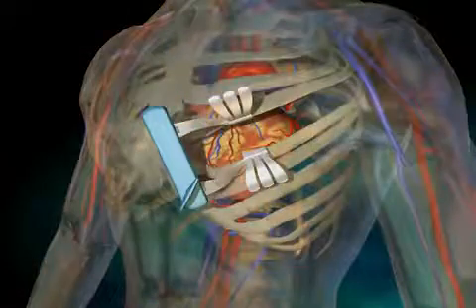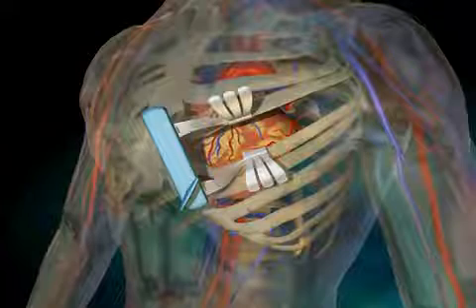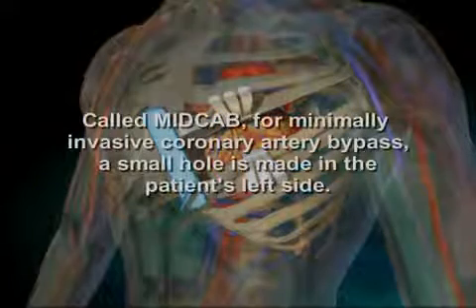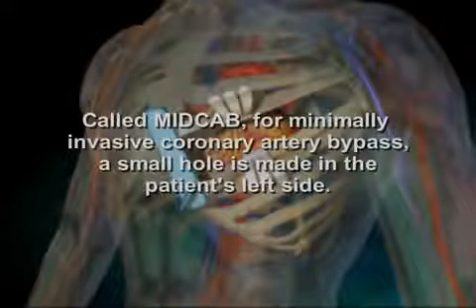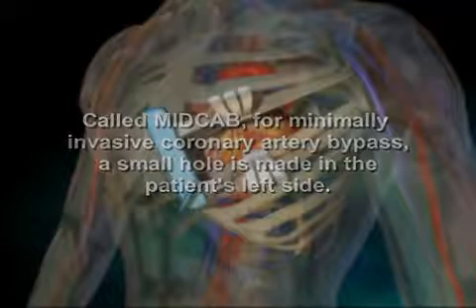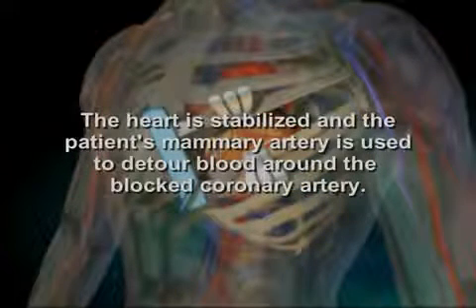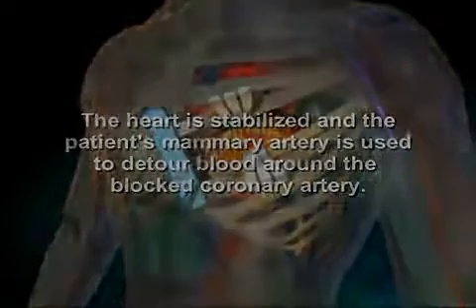Some patients may be candidates for a less invasive version of the OP-CAB, called mid-CAB for minimally invasive coronary artery bypass. A small hole is made in the patient's left side. The heart is stabilized and the patient's mammary artery is used to detour blood around the blocked coronary artery.